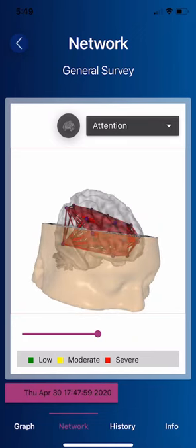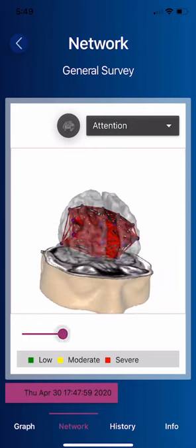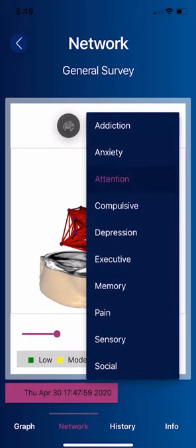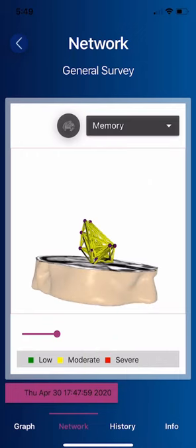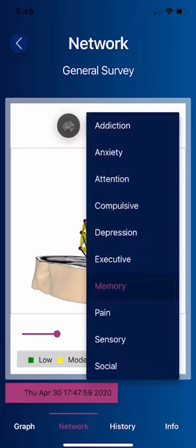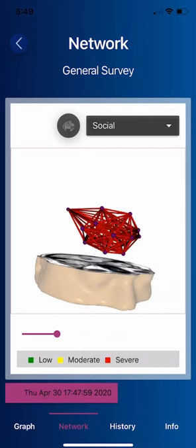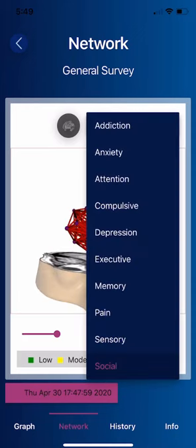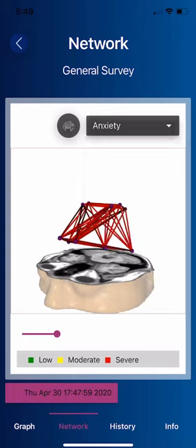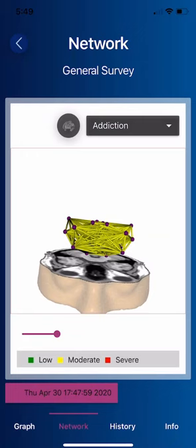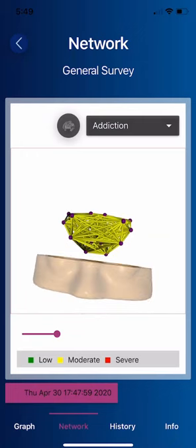Here's the attention network. I'll move this down so we can see it and remove the cortex. Here's the memory network — it's yellow because it's moderate. Here's the pain network, the social network, the anxiety network, the addiction network, and so on. This gives someone who fills it out honestly an evaluation of the severity of their symptoms as they link to the networks of the brain.